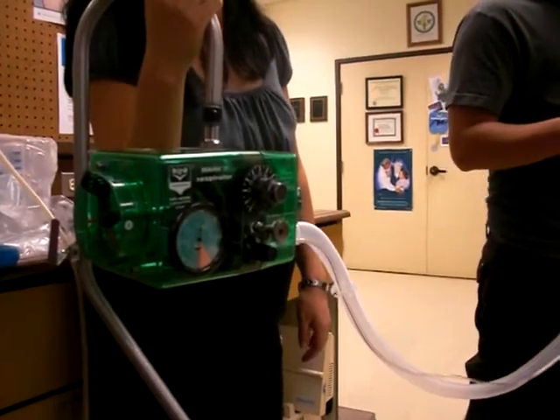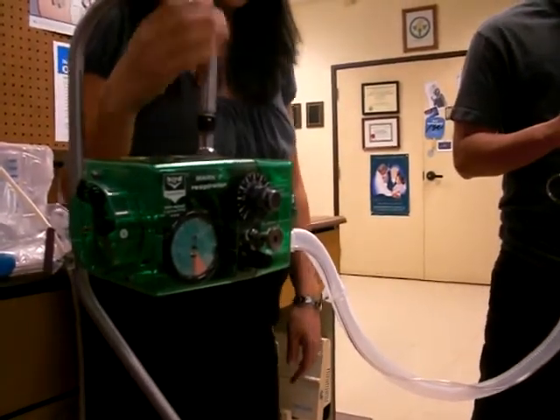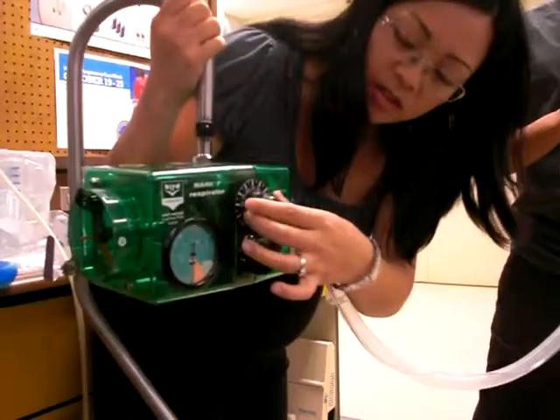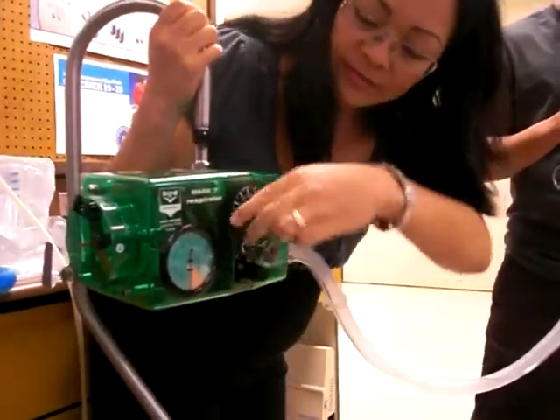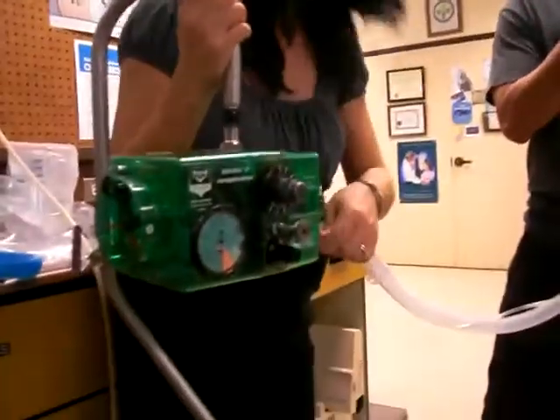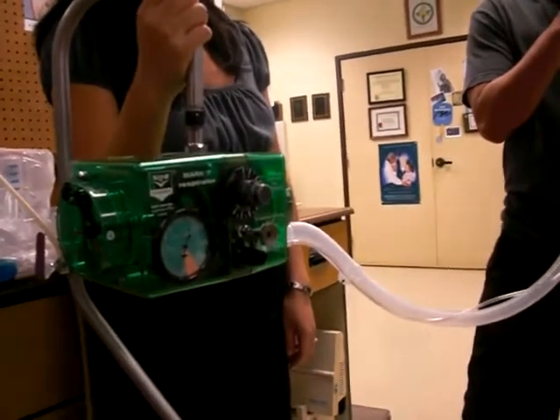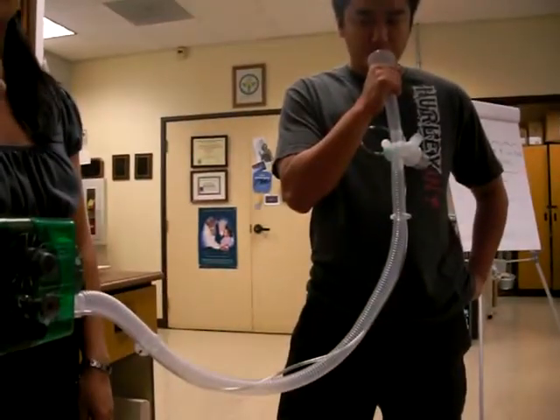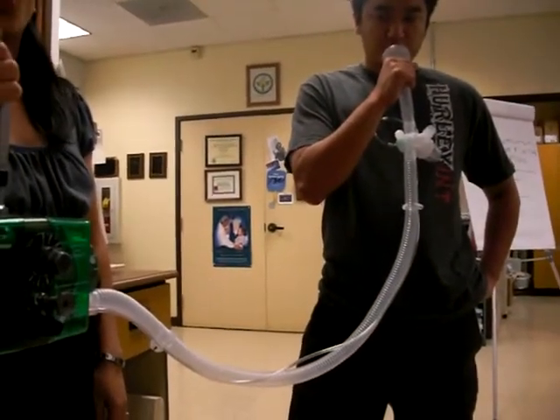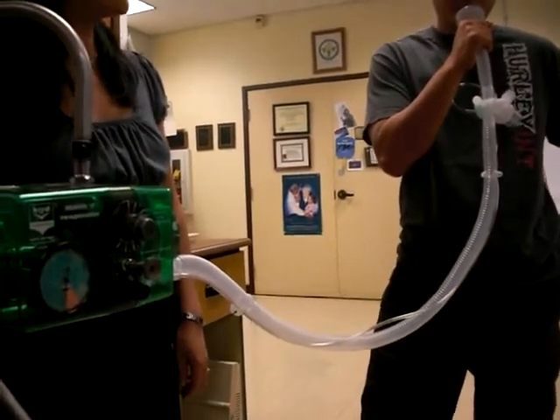Prolonged inspiration. Again, leaks, really long. Flow rate is too low. Okay, deep breath. Bryce. Flow rate, I mean, Austin, sorry. I saw Bryce. Deep breath. Is that 1 second? You can hear it. Oh, good breath.